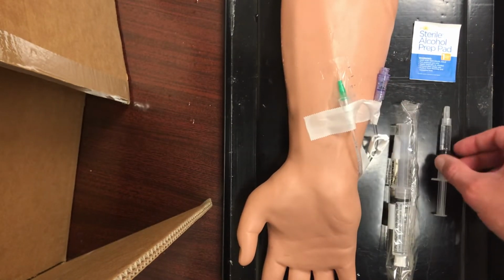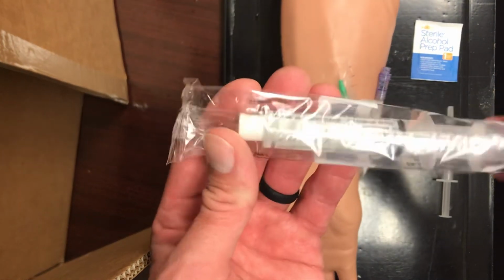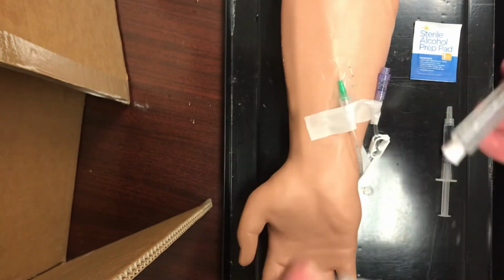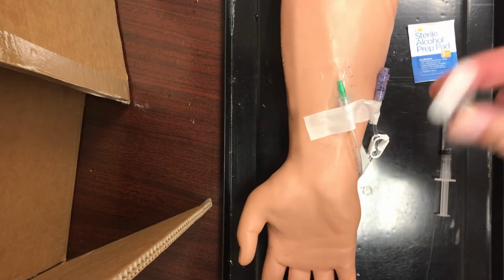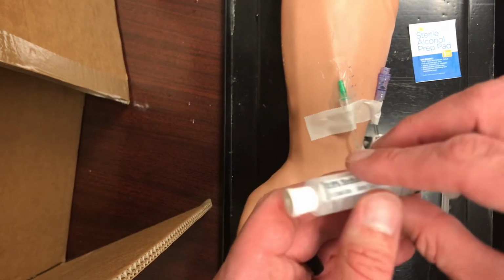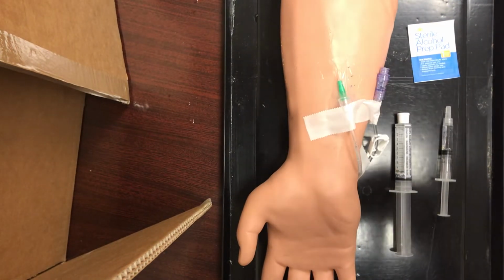So we have that here. And I'm going to open up a 10 ml syringe, so a flush, and prepare that. All of that is just taking it out of the container. Then I'm going to take the cap off, and we're going to break the seal in that, and I'll demonstrate that in a minute. First, I'm going to go ahead and put my gloves on.